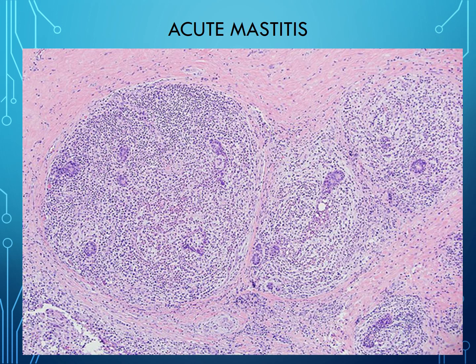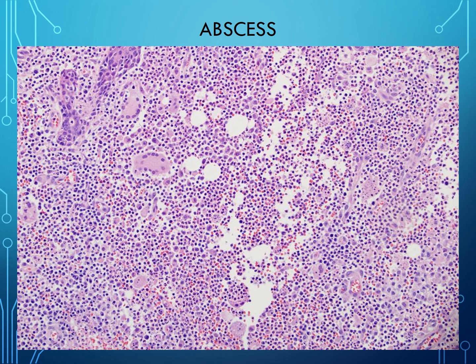Under the microscope, acute mastitis shows terminal ductal lobular units completely overrun by inflammatory cells, with only a few residual acini remaining. In an extreme case leading to an abscess, all that remains are maybe a duct or two, some multinucleated giant cells (histiocytes), and many neutrophils — which is essentially pus.